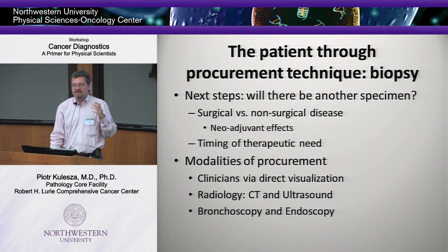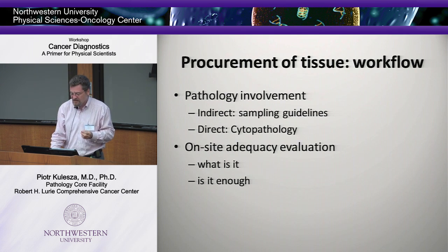So all of those considerations are very important for pathologists in terms of how somebody got there. The reason is I have to know this because there are different contaminants in different places that may affect my diagnosis, and they also will present non-lesional elements into the specimen. You'll see it on the case that I'm going to show you.